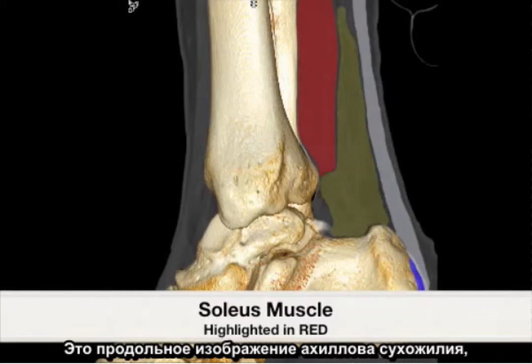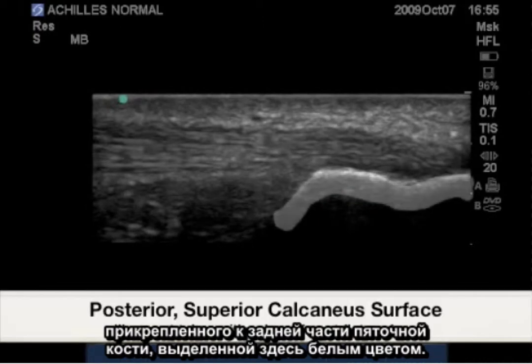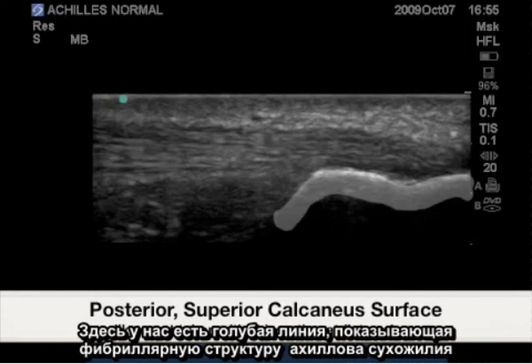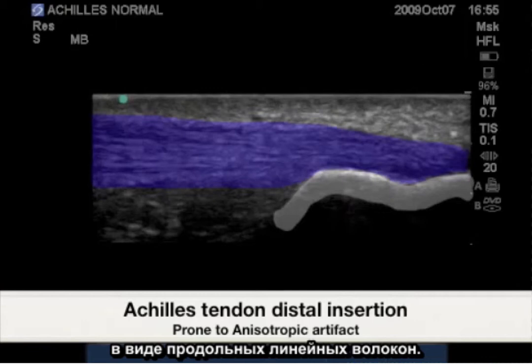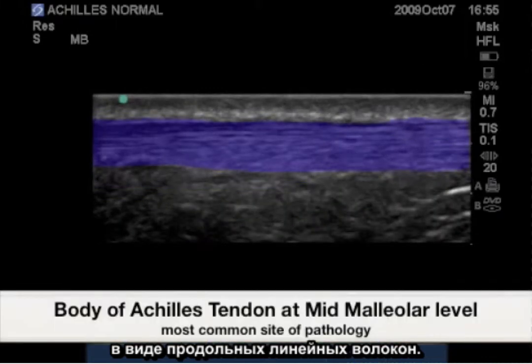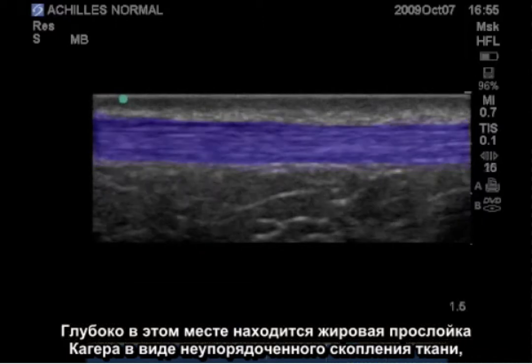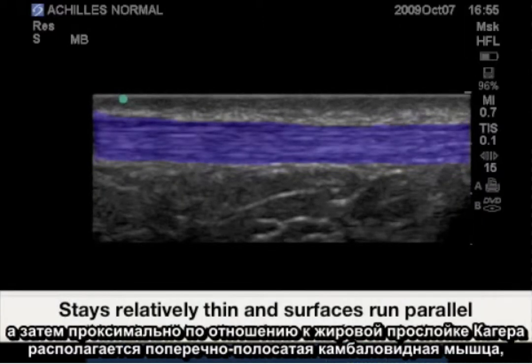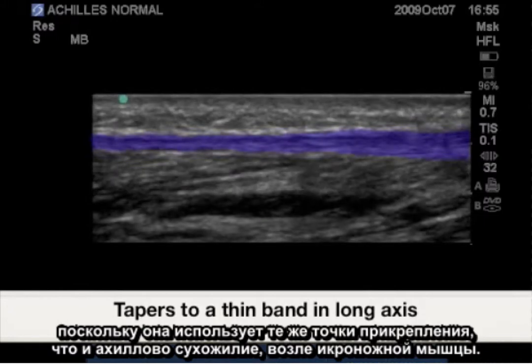Here is a longitudinal image of the Achilles tendon inserting to the posterior calcaneus, highlighted here in white. The trace in blue represents the Achilles tendon fibrillar pattern as longitudinal linear striations. Deep to this is Kager's fat pad as an unorganized collection of soft tissue, and then proximal to Kager's fat pad is the linear and striated soleus muscle as it also shares insertion points with the Achilles tendon near the gastrocnemius.